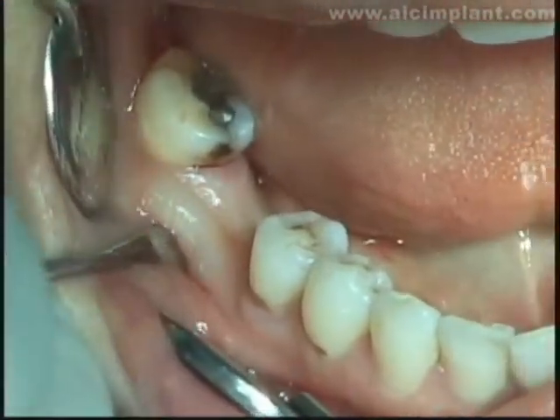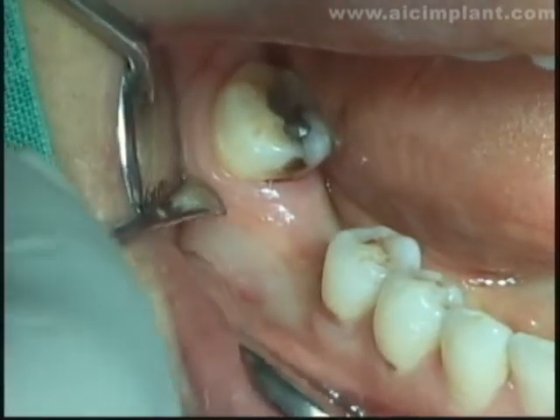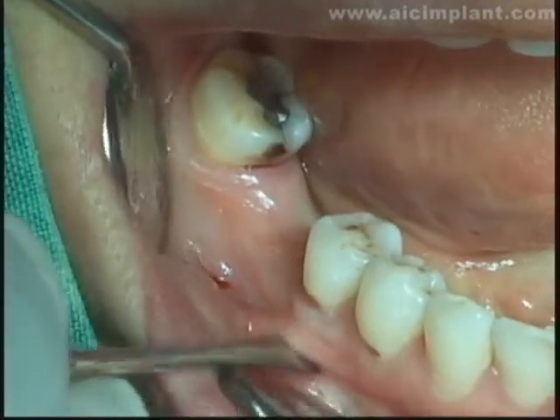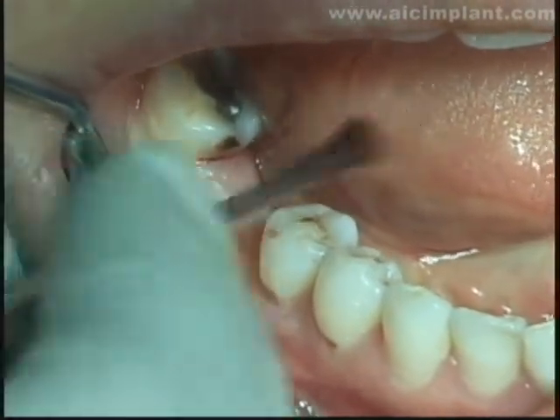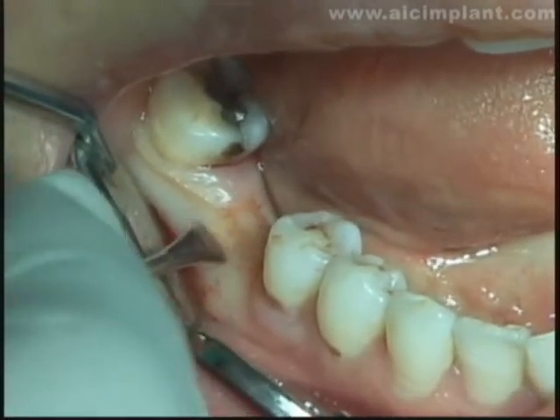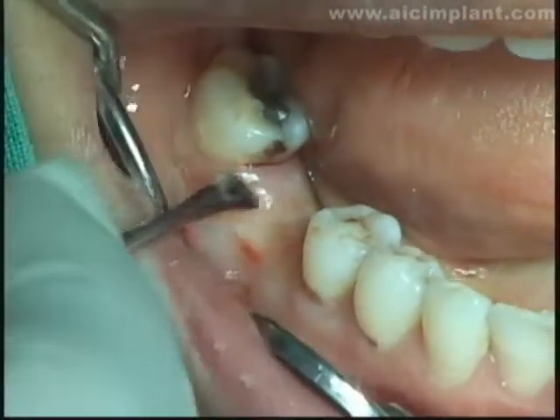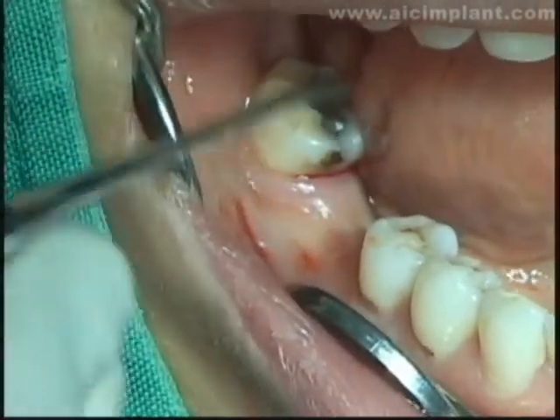The hard tissue condition is fairly good. If the attached gingival line had passed about here, I would have gone for flapless surgery without any second thought. As you can see here, however, the mucogingival junction is at this position, leaving a hole formed on this area had flapless surgery been done. When a hole is formed, the buccal has no attached gingiva. Thus, for better results, the incision must be made slightly lingually and then sutured.